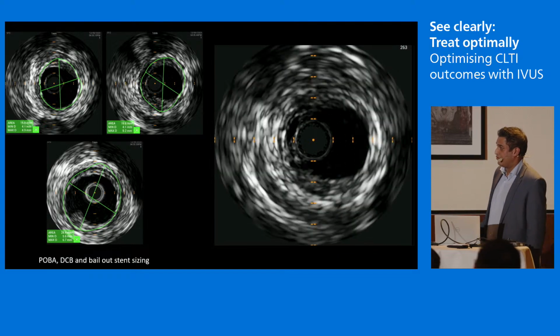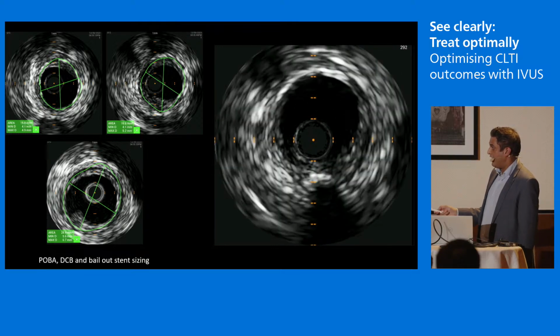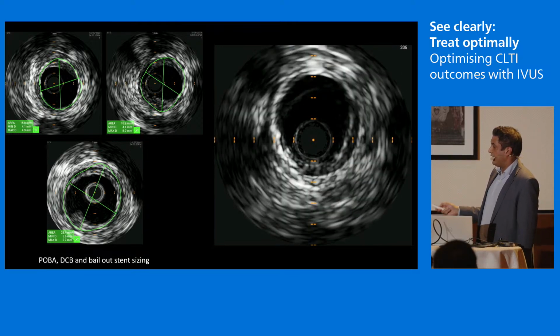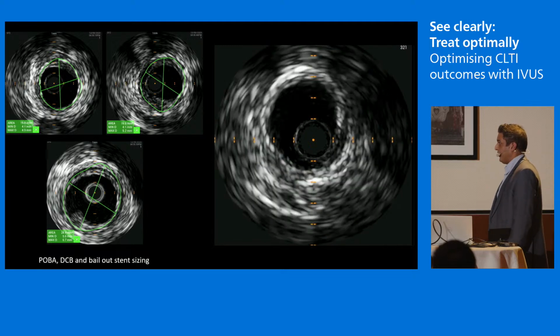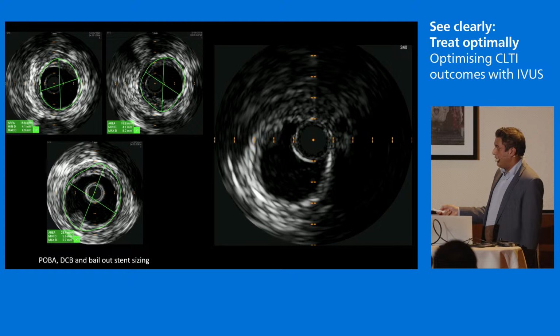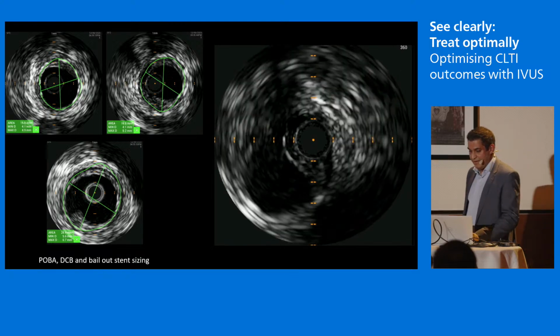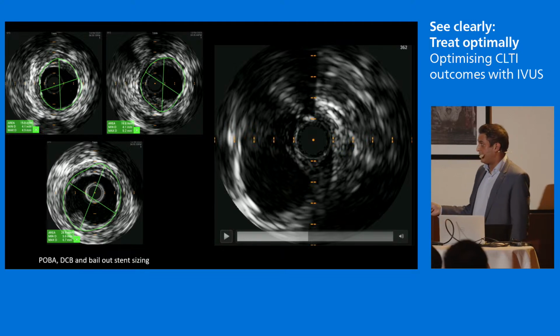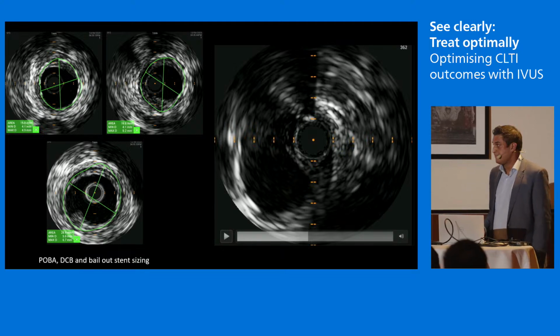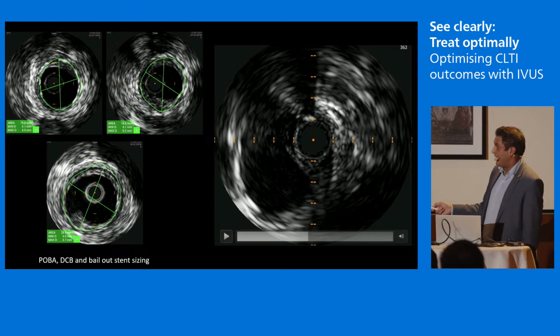So here are the vessel measurements. Have a look at the IVUS pullback. So we're in the lumen here. Okay, bit of plaque here. Nice wide open lumen distally where we've re-entered or entered the below-knee popliteal. Eccentric plaque here because you can see some calcium. But can you see what's happening here? Can anyone have an idea of what's going on here? Some people call it the snowman sign.